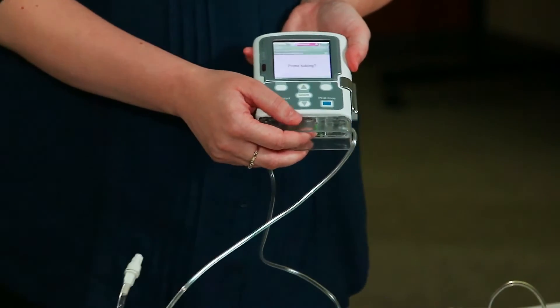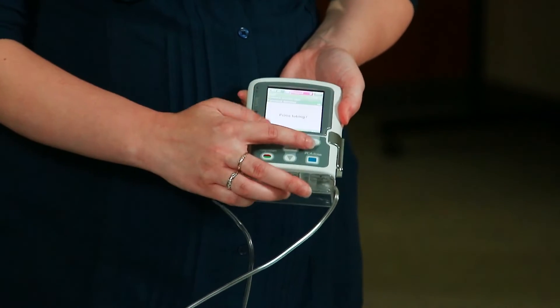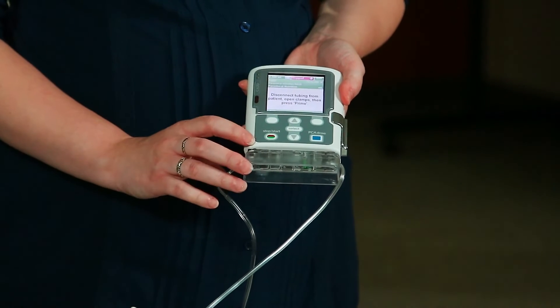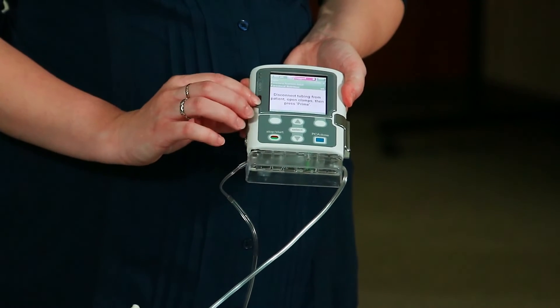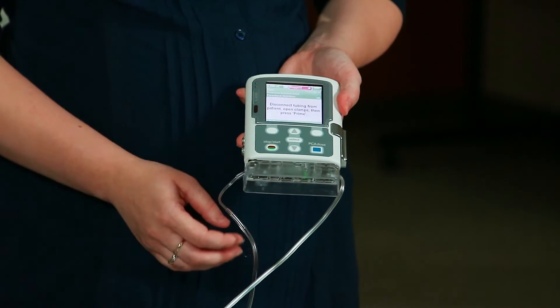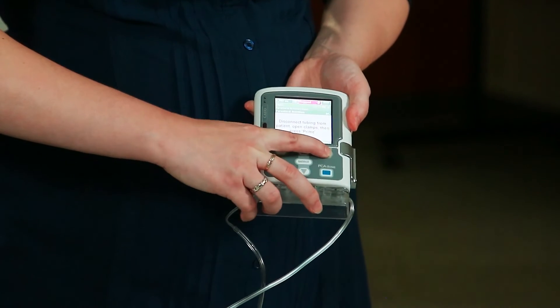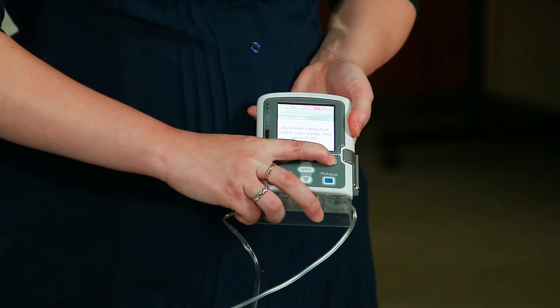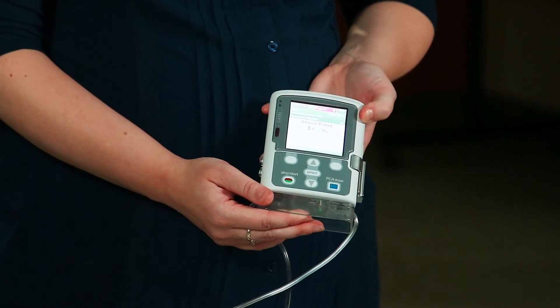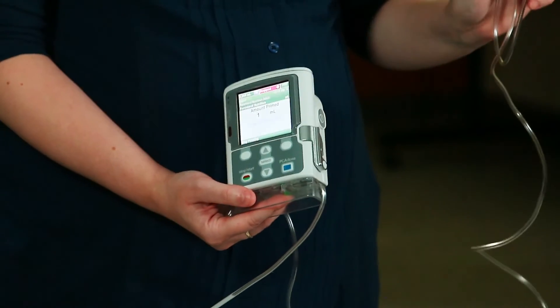Now a message will display 'prime tubing.' You want to press the soft key 'yes.' It will then bring up a message that says 'disconnect tubing from the patient, open the clamps and press prime.' You are then going to push the soft key right under prime. This pump will automatically prime your tubing with 20 mils of fluid, which should be enough to get to the tip of the end of your tubing.